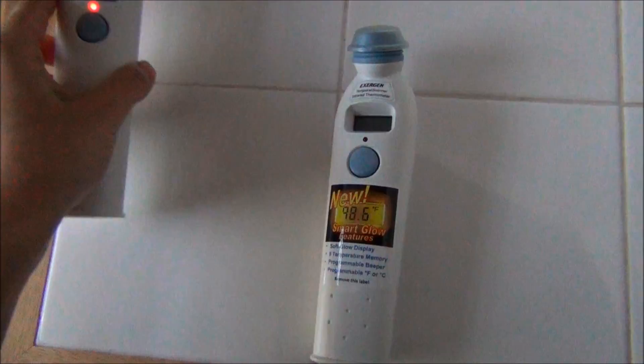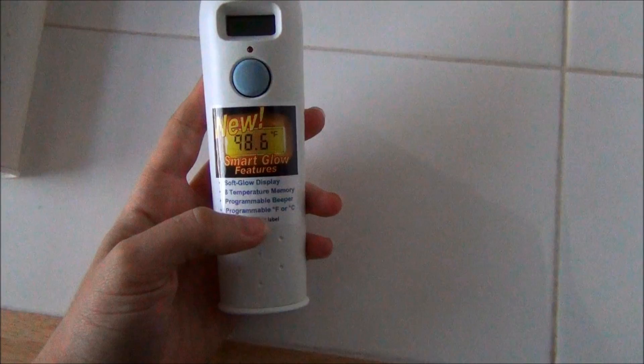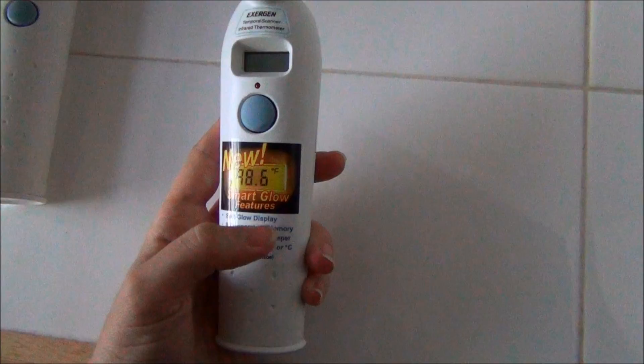So they came out with a new thermometer. It's their SmartGlow feature. It also has eight programmable memory with a programmable beeper — we actually turned the beeper off — and you can put it on Fahrenheit or Celsius.